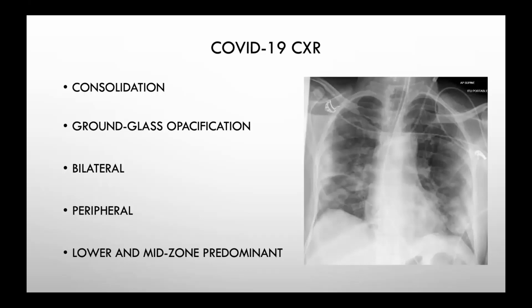COVID-19. So I think COVID-19 is really, really hard when you see the chest x-rays coming in. And in terms of how it's presenting, it's virtually impossible because we do chest x-rays on everyone that comes in, not just people with respiratory complaints. And I think we're picking up a lot of pathology on patients who've come in for completely unrelated reasons.